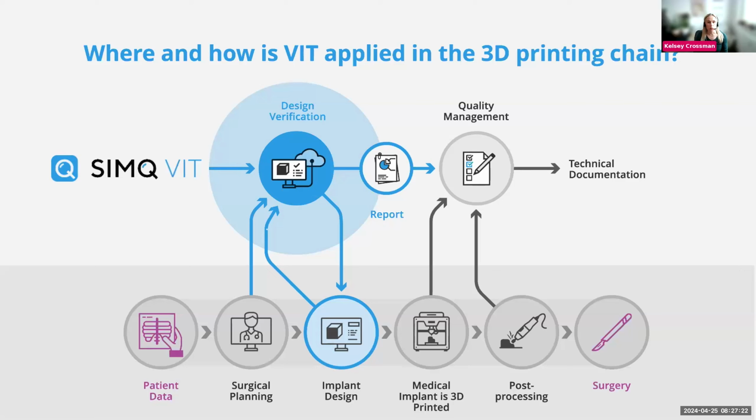So the next question is, where and how is virtual implant testing applied specifically in the 3D printing chain? So we talked about automation, and yes, we know that you can 3D print implants, but how does that play out for medical device manufacturers and clinicians, and how do you get that to the patient?